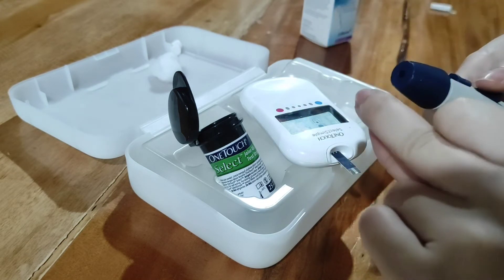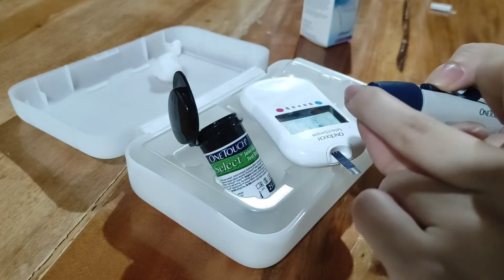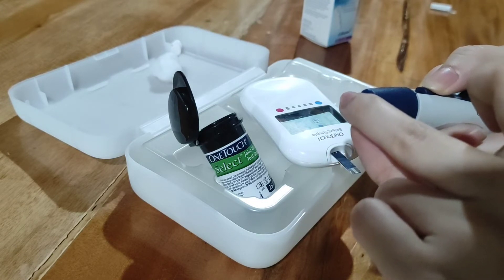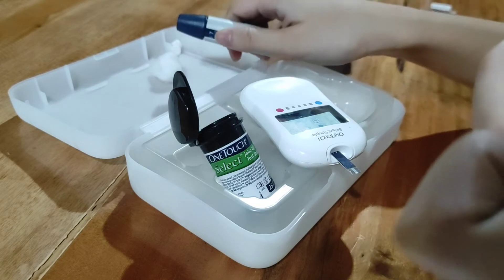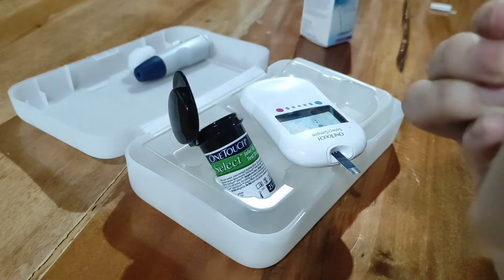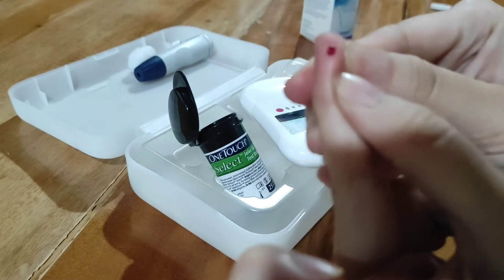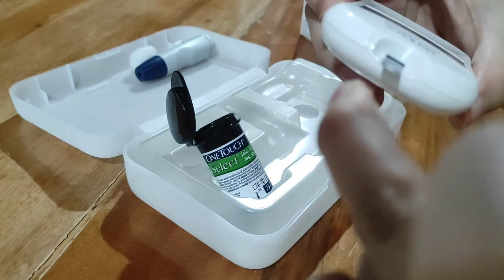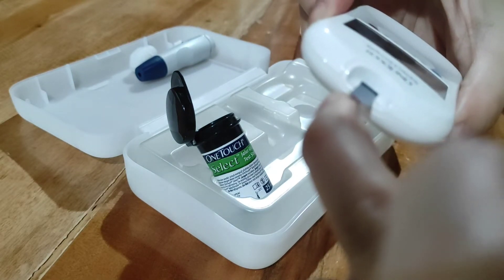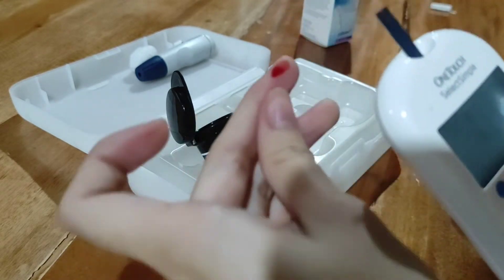One, two, three — we're just going to push this one. Okay, kita nyo — nagdugo. And then pasok natin sa ating glucometer.